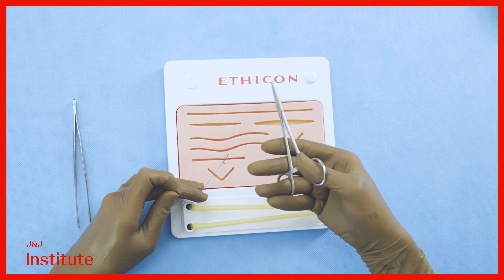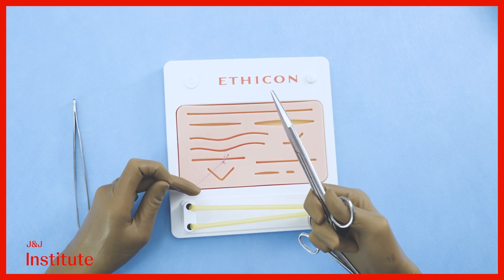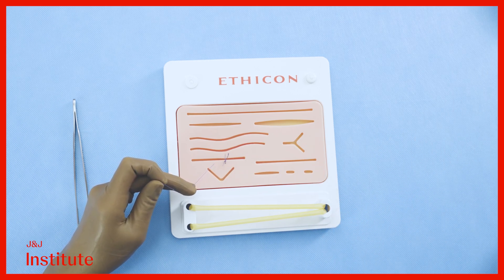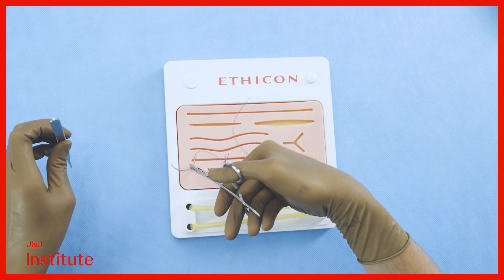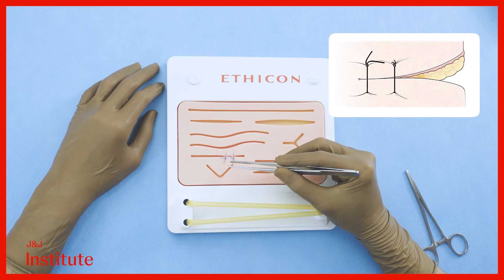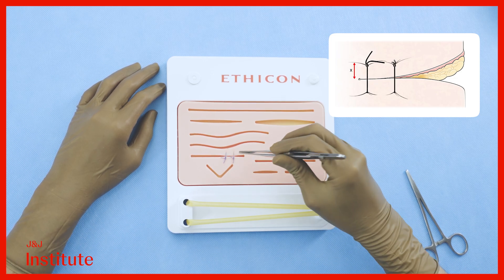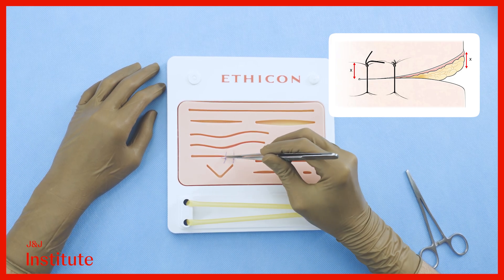Palm the needle driver in the right hand, pick up a pair of scissors, cut the suture, lay the scissors down, and continue with the suturing. A general rule of thumb is that the distance between the needle and the incision is the same as the depth of the needle pass.